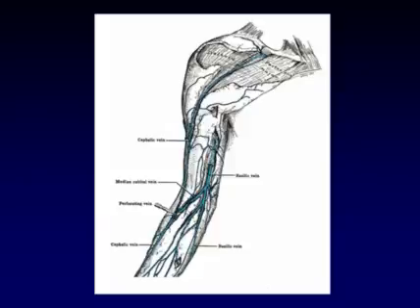Now, as part of our routine examination of the upper extremity veins, we do not tend to include the cephalic vein. This is a large vein that, as I mentioned, extends along the lateral side of the upper arm and then anastomoses with the branches of the basilic and brachial veins in the antecubital fossa.